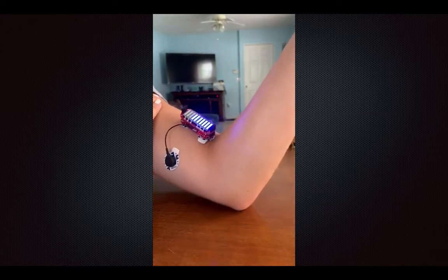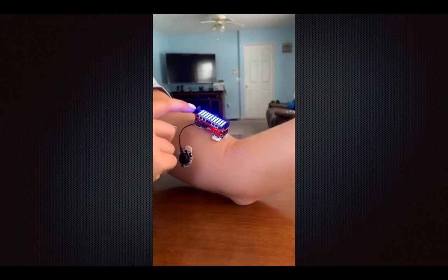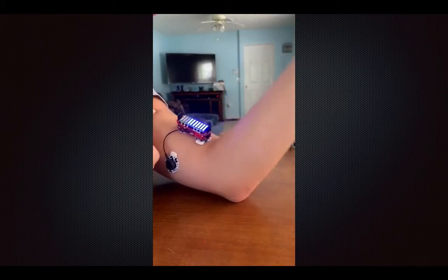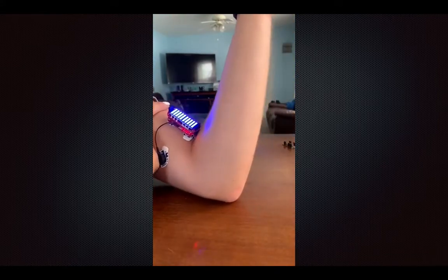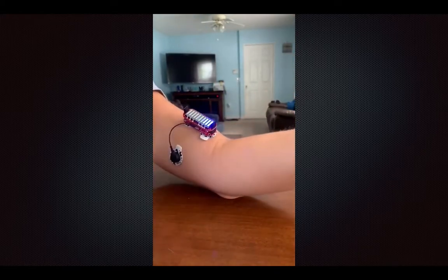So when I go like that, it sends you a bar to show how much muscle movement there is. So when I'm fully flexed, it should hit the top of the bar.